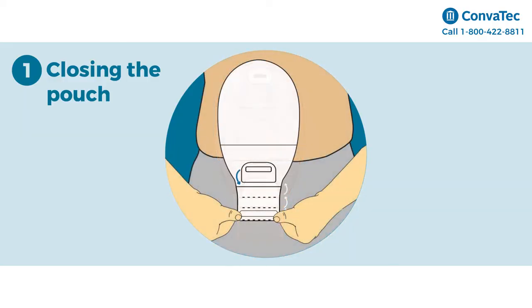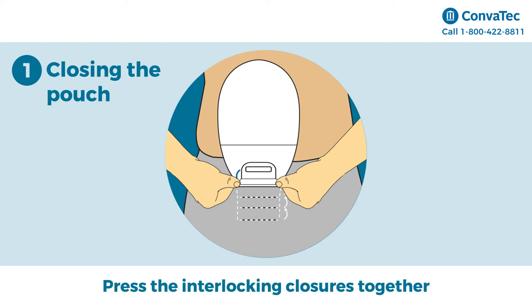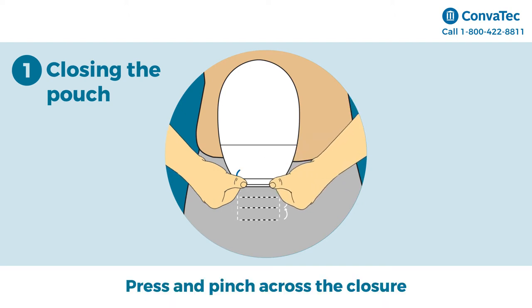Step 1: Closing the pouch. Start by folding the end up towards you until the interlock enclosures line up. Press the interlock enclosures together across the width of the tail. Press and pinch across the closure until you feel them close.